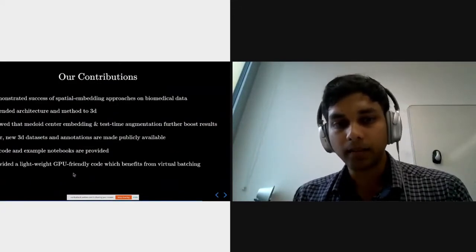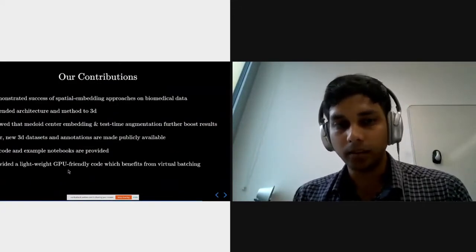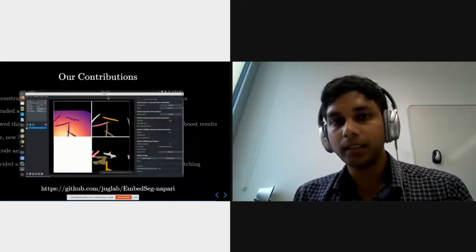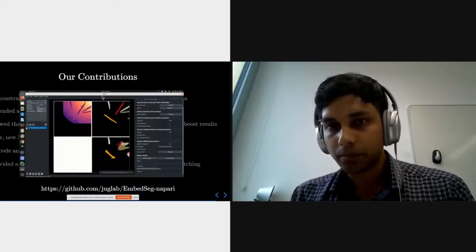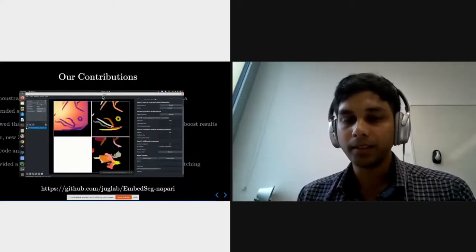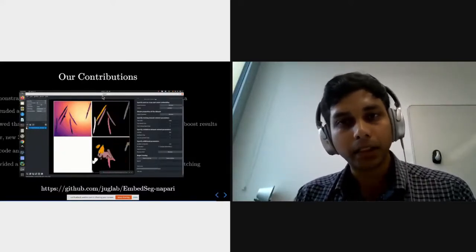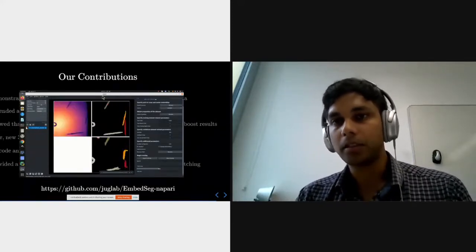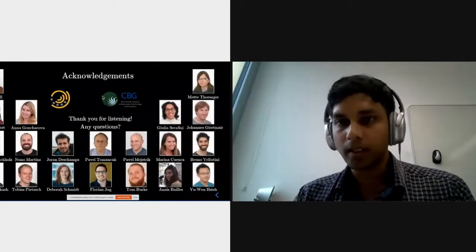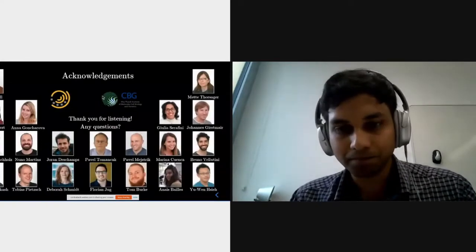We are also integrating EmbedSeg with a GUI. You can see training on the GUI — this is a work in progress. We hope that with this, people can train EmbedSeg on standard laptops with modest GPUs with ease. With that, thank you for listening, and I'm happy to take questions later.